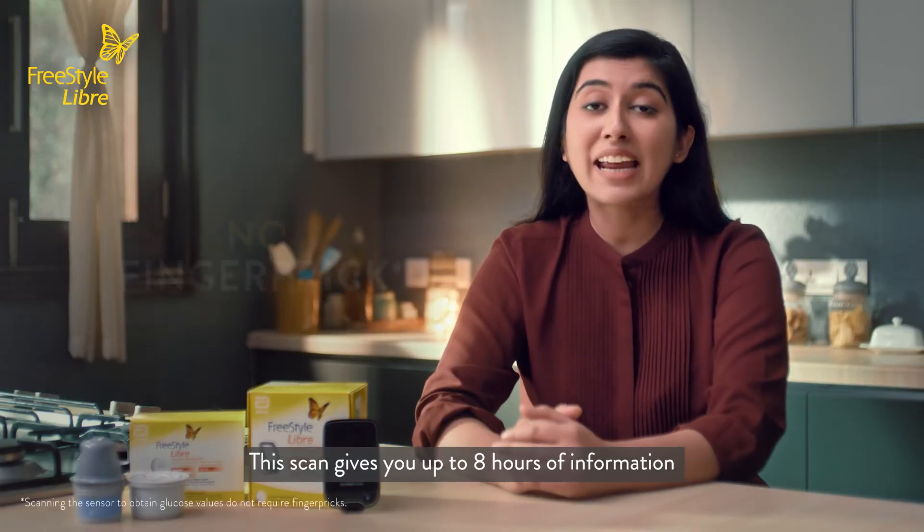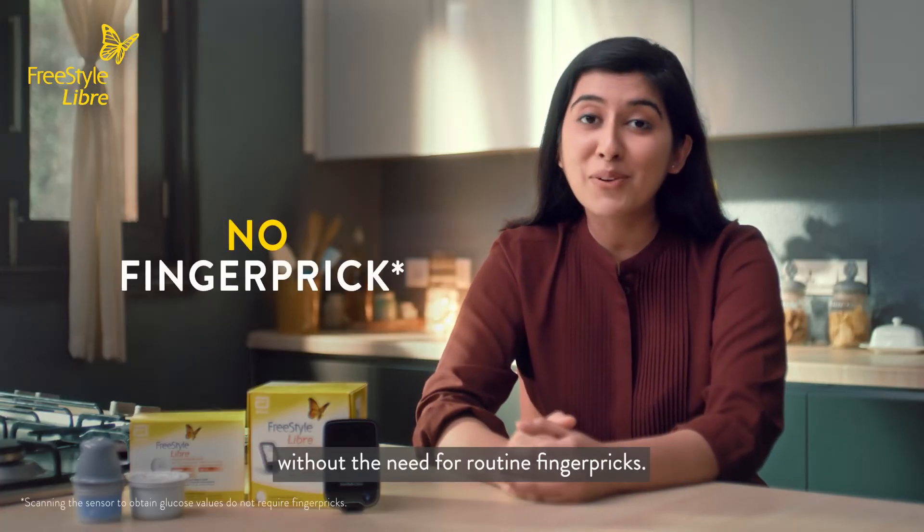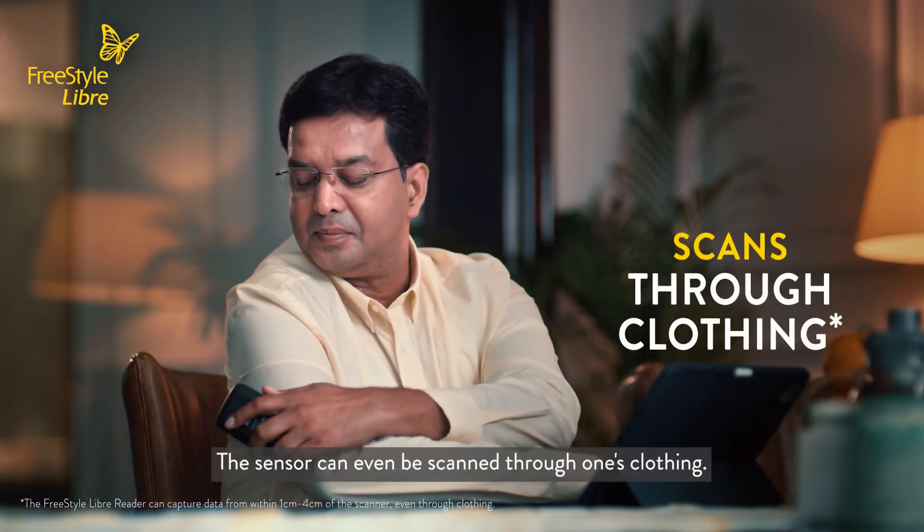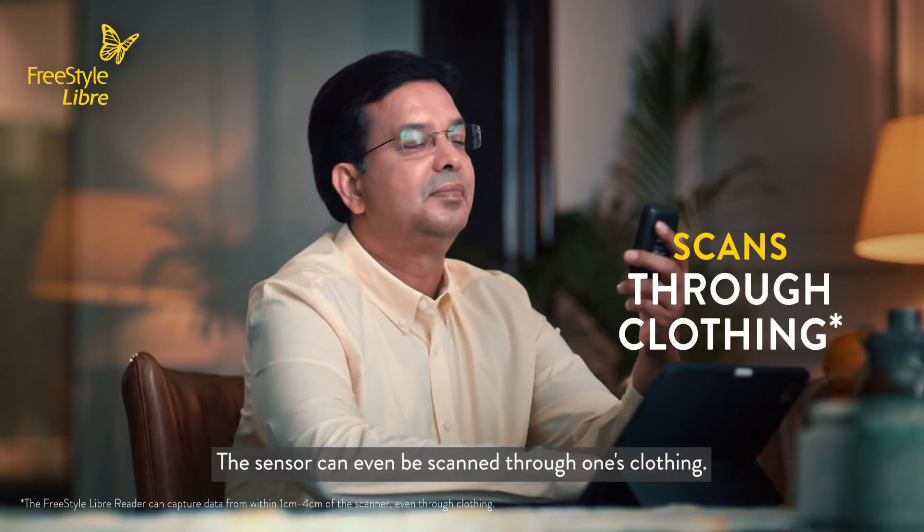This scan gives you up to 8 hours of information without the need for routine finger pricks. The sensor can even be scanned through one's clothing.